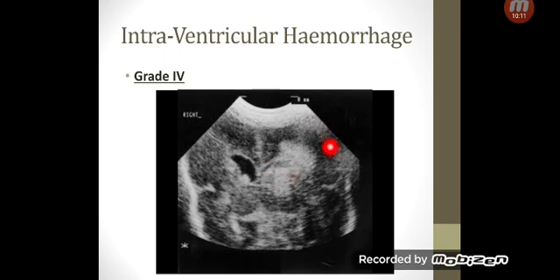You can see that here as well. And you can see that there's a midline shift. It's pushed to the right side. The whole cerebral content is pushed to the right side, and you can see a bit of dilatation on the right ventricle as well.